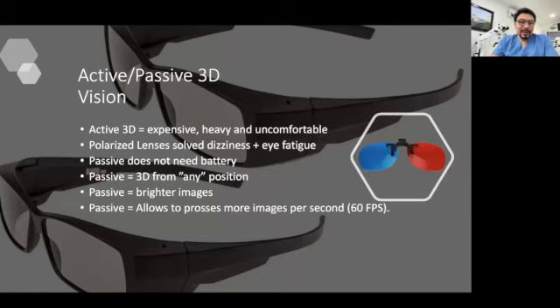And you know, it's funny because during the International Dental Show this year, a friend of mine who is in charge of a company that is doing microscopes called me and told me, you know, Jenner, we are working on a 3D microscope. We know that you already have the experience with this technology. Can you please come and let us know what you think? I went there. As soon as I saw the microscope, I noticed that the vision was positive. The 3D vision was positive.